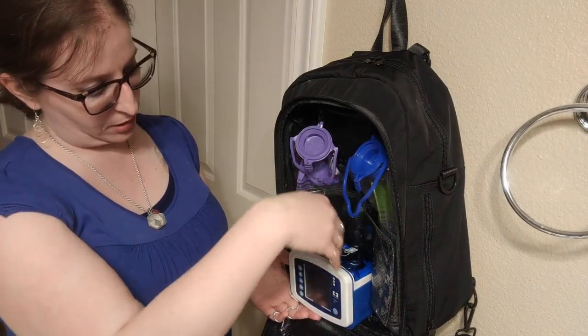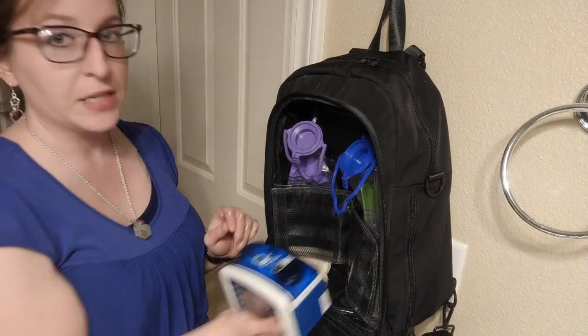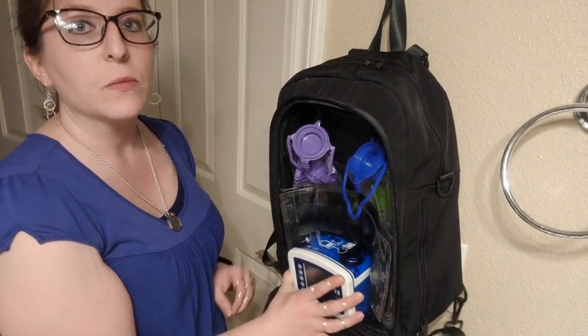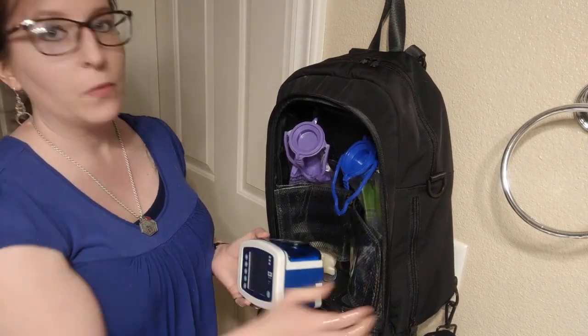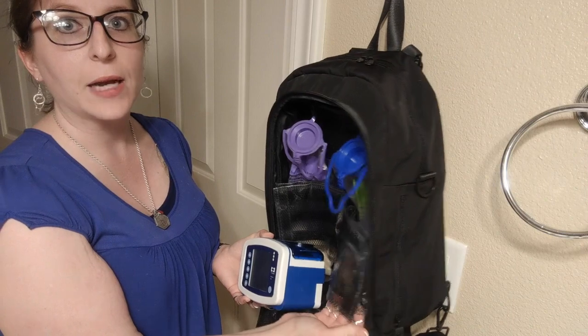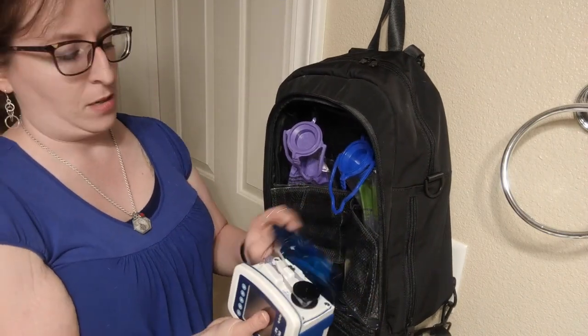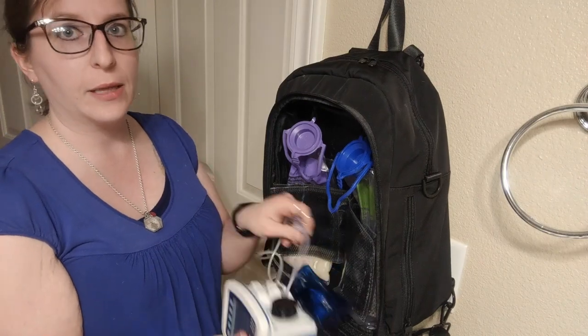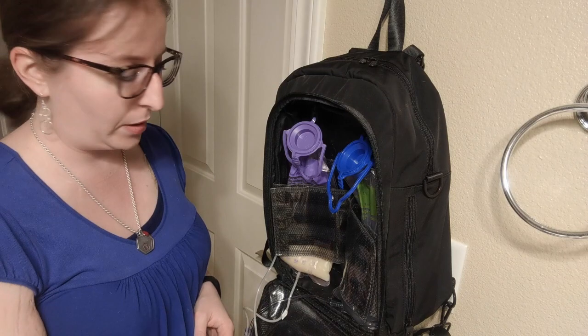Wait for it to do its thing. Okay. So then now I can take this out, and this is just sitting in there. That's the one thing about the Joey pump. Like the Infinity pump and whatnot, you can actually fit in one of these side pockets. The Joey doesn't fit, but that's fine. So take that out. That's the old set. And just put the pump on the side for right now.